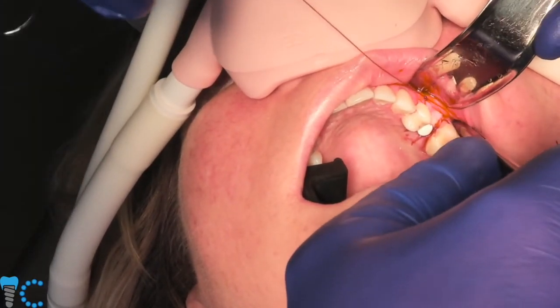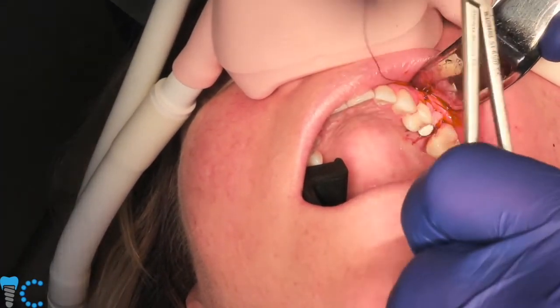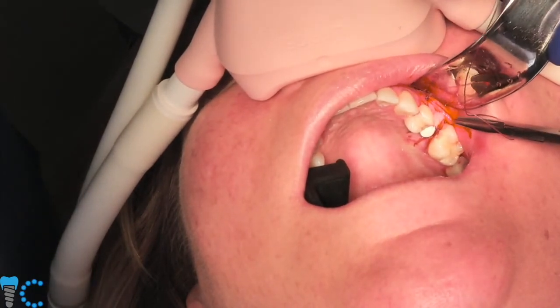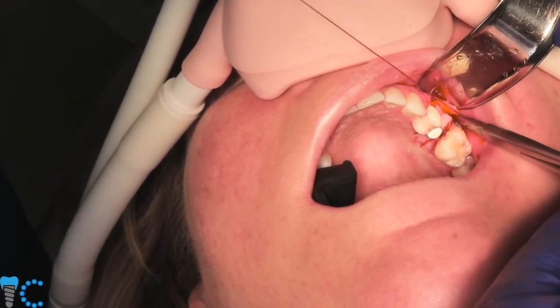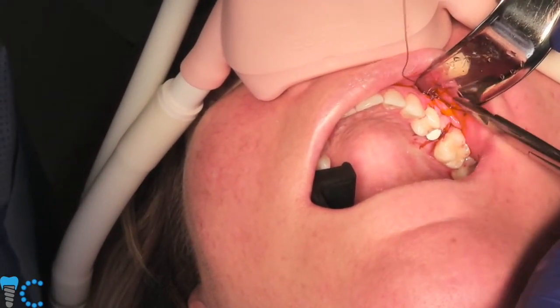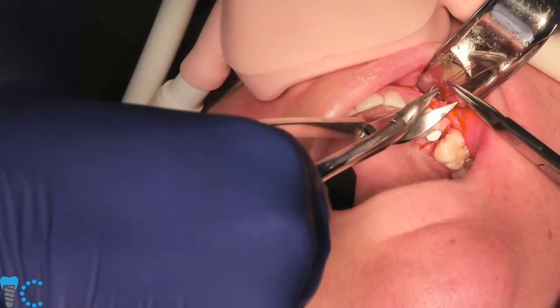So we do crown down design. We design what it is we want from our implant placement, our implant selection, based on what tooth we're trying to replace. So tissue seems to really like ceramic. Why is that, in your opinion?